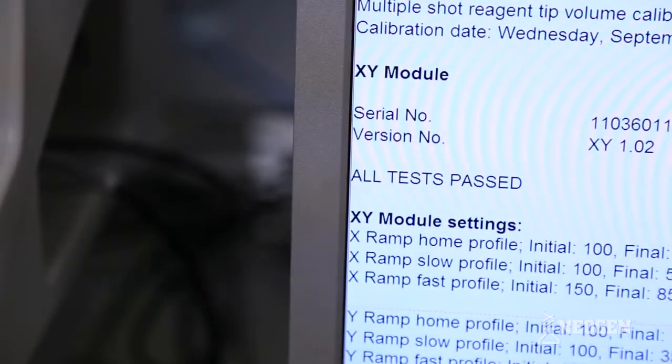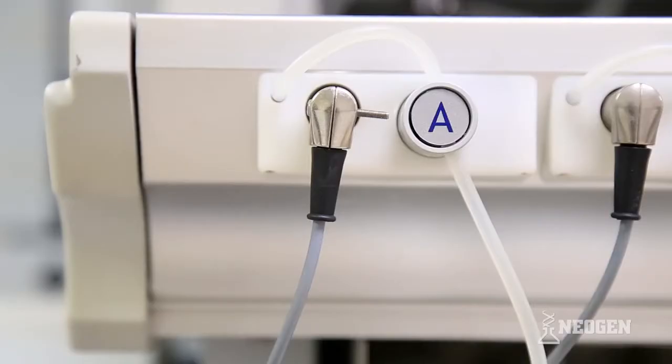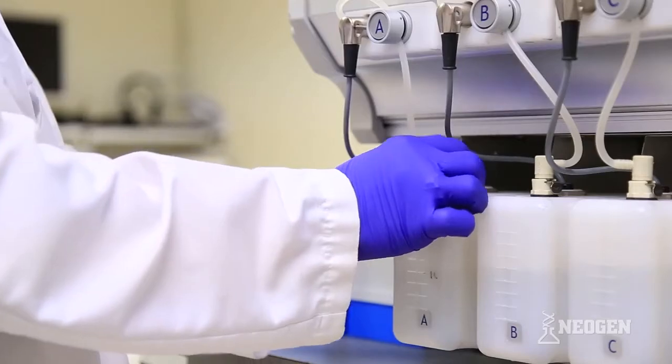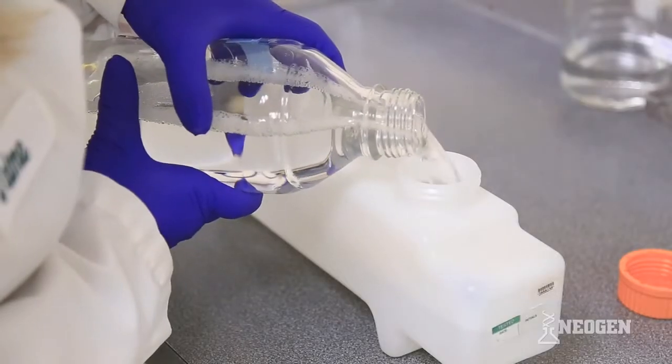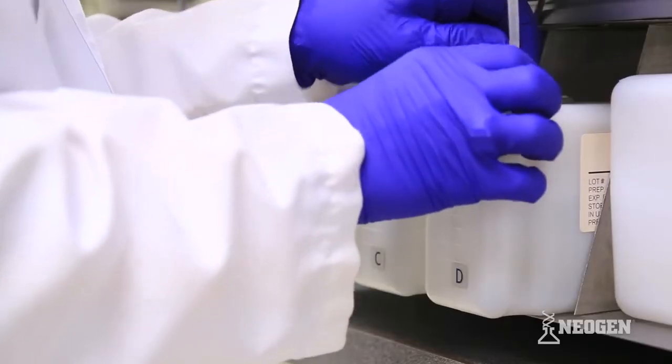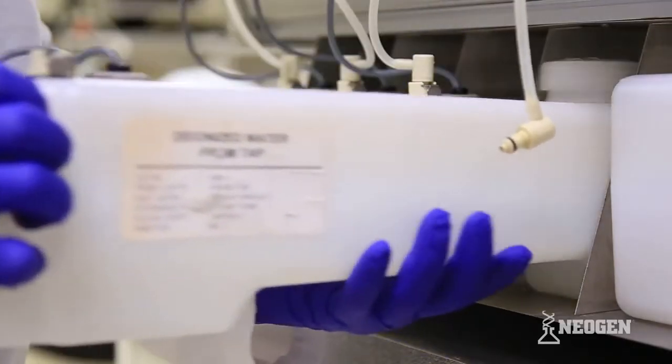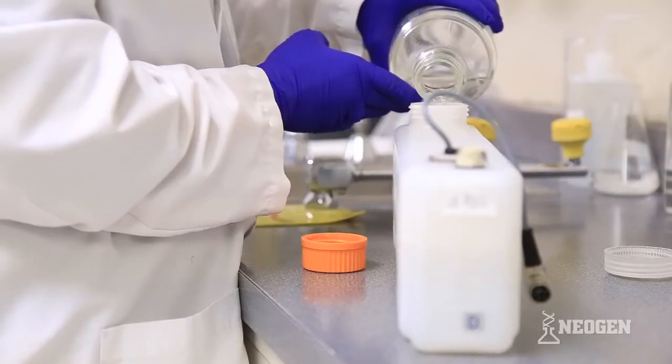If all tests pass, the instrument is ready. Wash bottle A will need to be checked for adequate amounts of wash buffer and if needed, diluted wash buffer will need to be added. Wash bottle D will need to be checked for adequate amounts of DI water and if needed, DI water will need to be added.